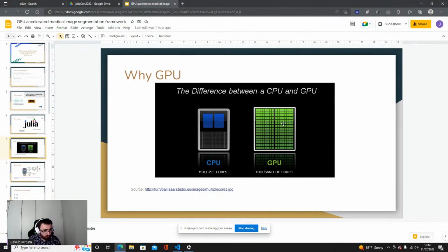With such a huge amount of points to analyze, we can divide the algorithm to work on each point or on each group of points separately. So the more threads we have, the more work we can parallelize. And in practice, there is really little limit to this. So this data is really good for parallelization for a lot of types of algorithms.